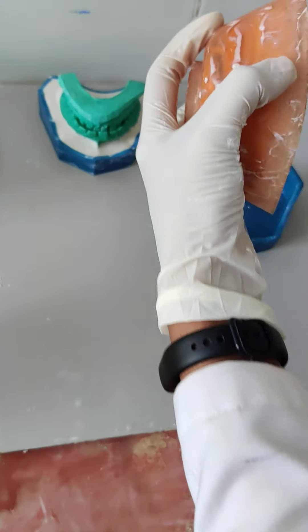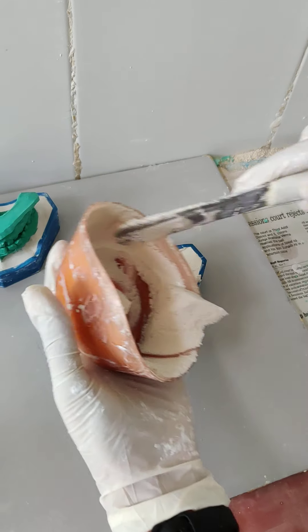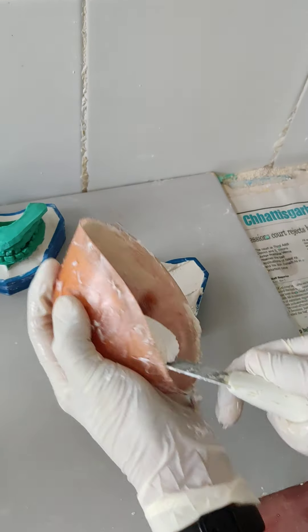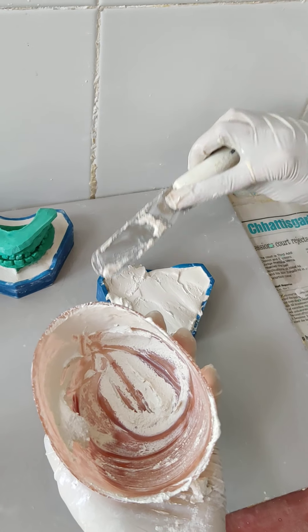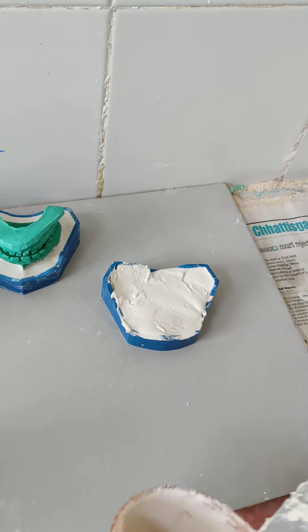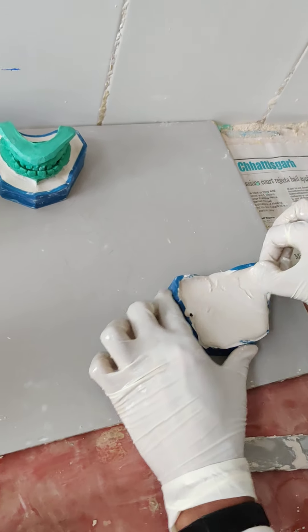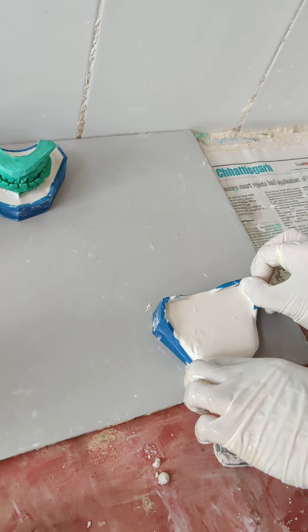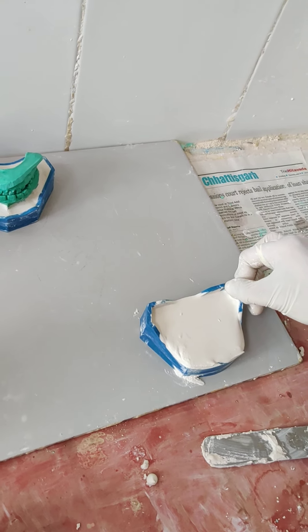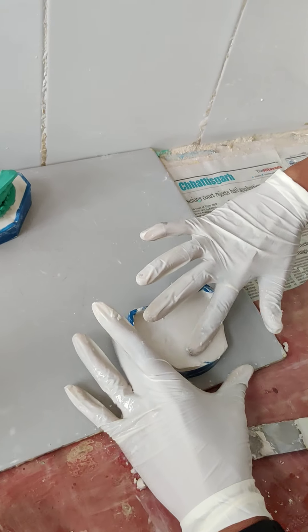After tapping, transfer the plaster from the bowl into the mandibular base former. Apply it evenly at all parts. Tap it again to ensure that the plaster reaches every area of the base former, and remove the excess with your finger, making sure your work area is nicely cleaned.